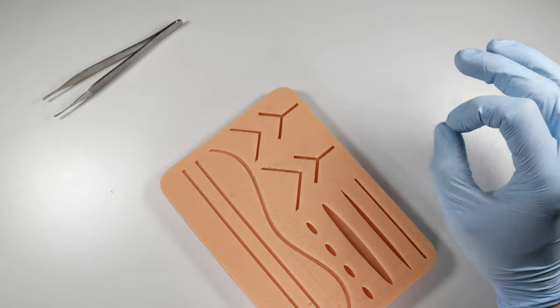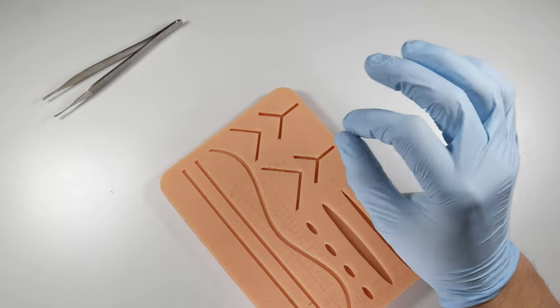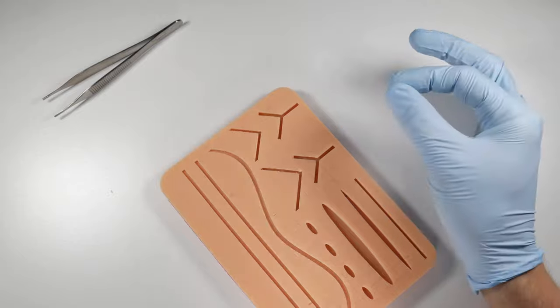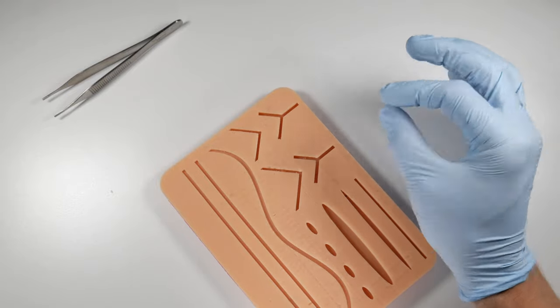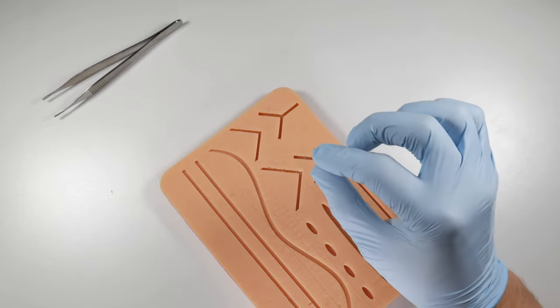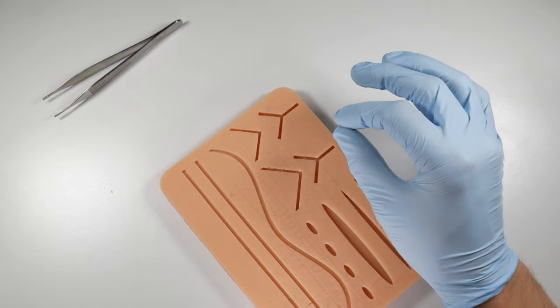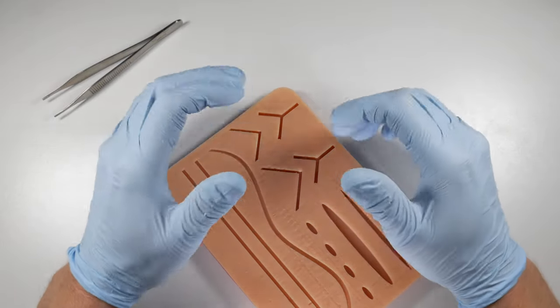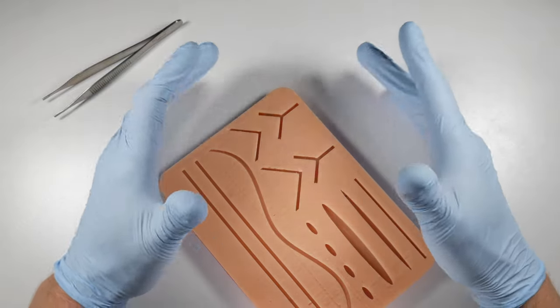The smaller the suture, the more delicate the suturing. So if you have a torn flap for example, you might want to use a 6-0 or a 5-0 suture that's going to be much finer than say a 3-0 suture that you may use normally for good strength to resist the tissue pull in an area where you've done a surgical flap.